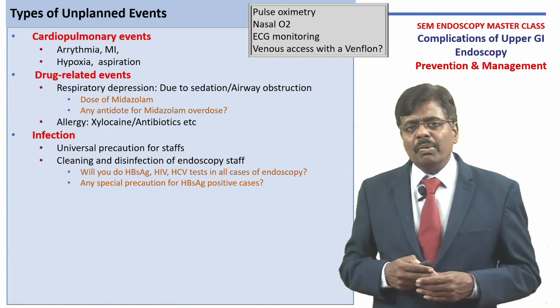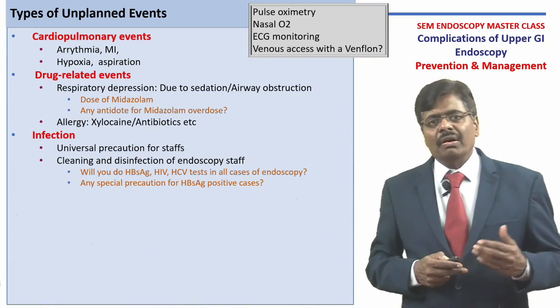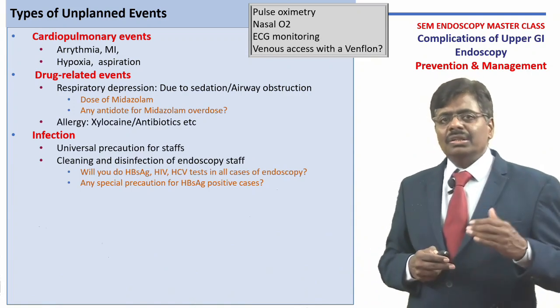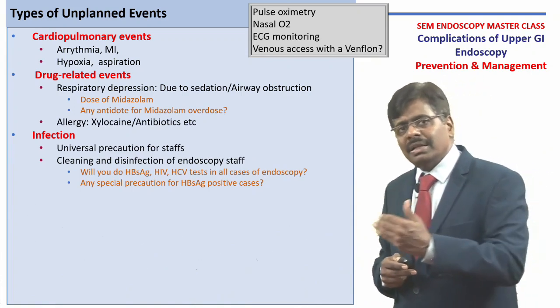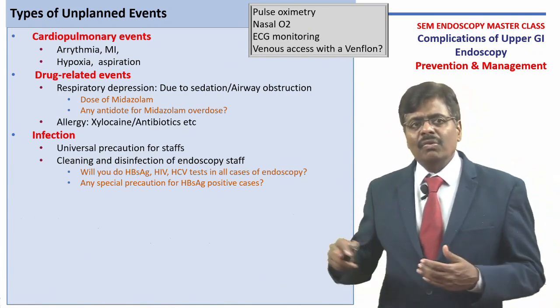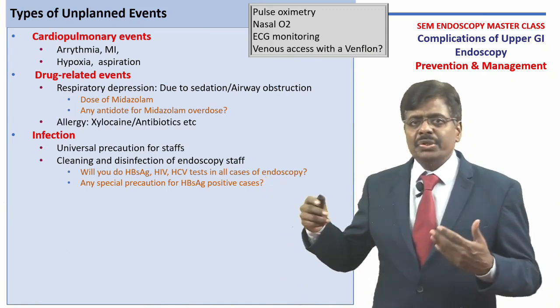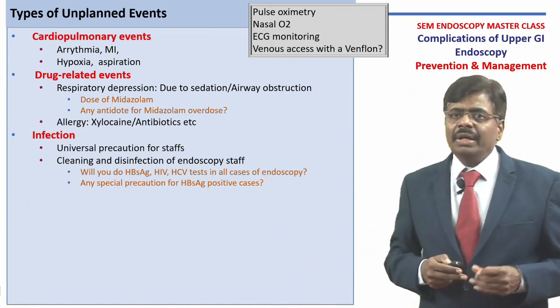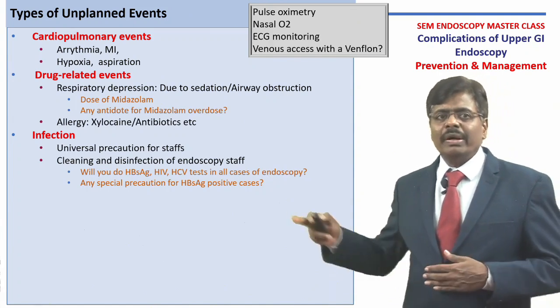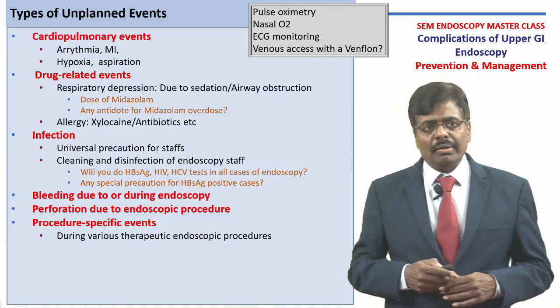But what is more important is, if you already know this patient is HBsAg positive or HIV infected, those cases can be kept as the last case of the day. That is the additional advantage of doing all these tests, but I think this is institution based. I do not think it is absolutely necessary, provided you take universal precautions and strictly follow the disinfection protocol.